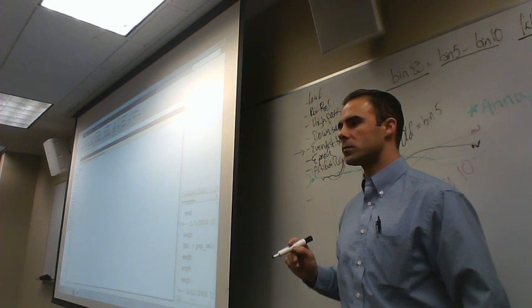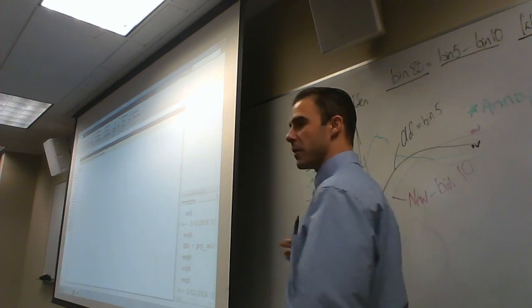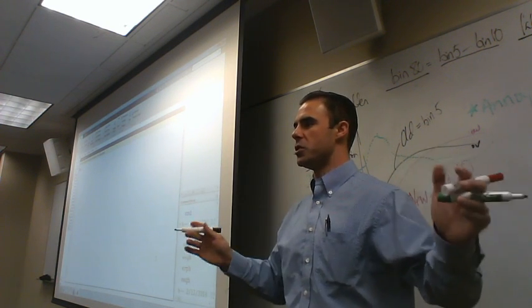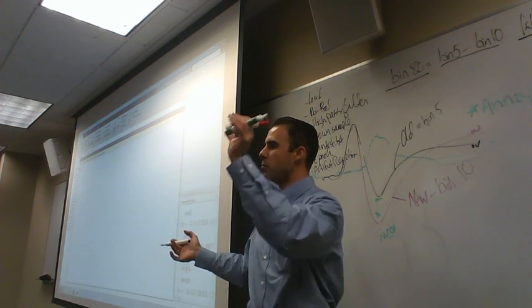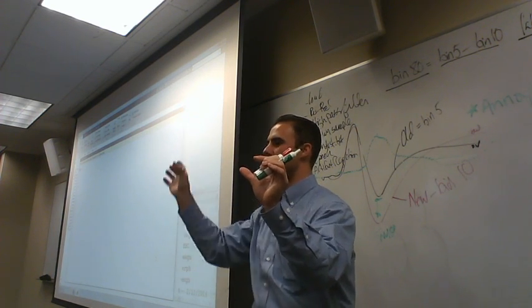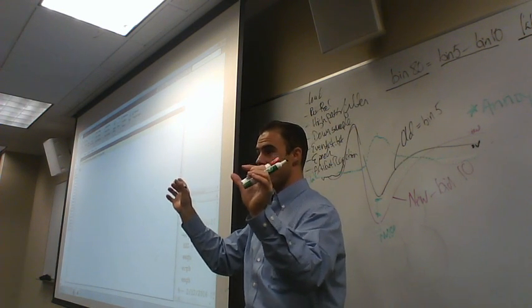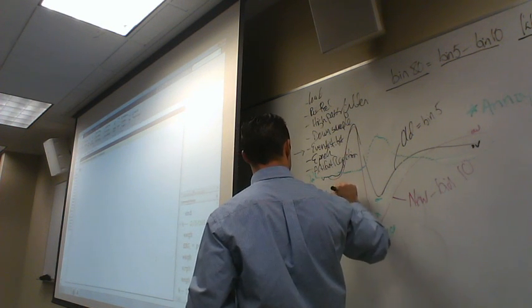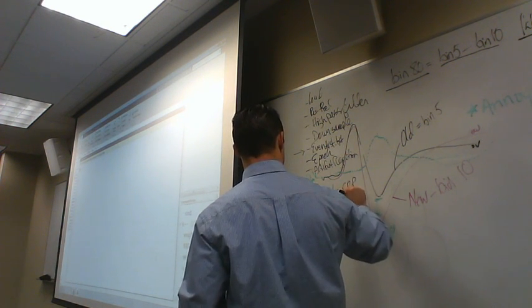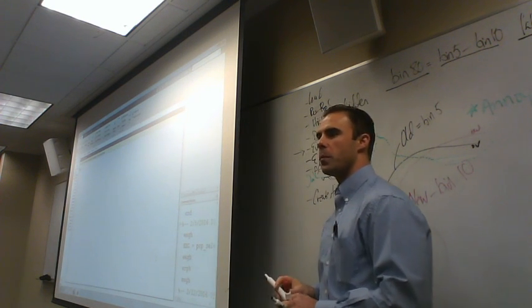Is that whenever we created the average ERP? Yeah, you want to create an average ERP. So now we make that fundamental shift from EEG data to ERP data, right? So we stop using the menu in EEGLAB and we start using the menu in ERPLAB in our GUI. You guys remember how we sort of switched there? So now we're going to create average ERP, and that's going to give us a .erp file output.